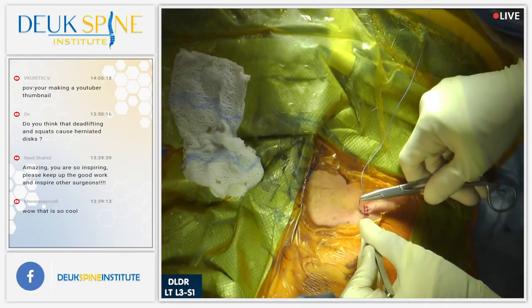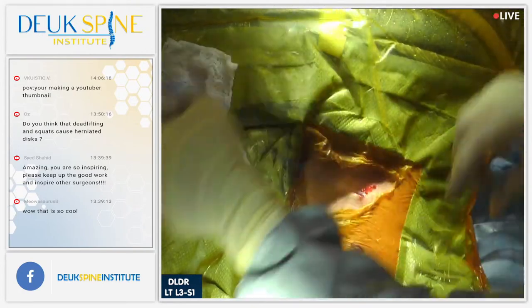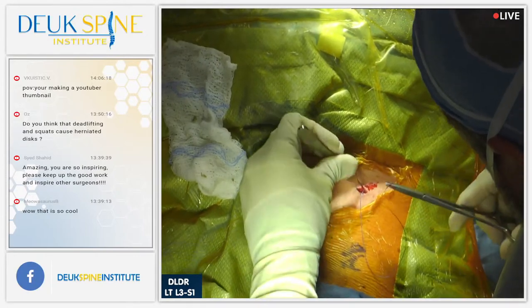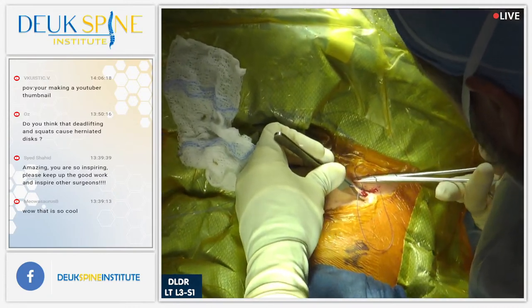Blood loss 1 mil. DLDR. This was a left L3-4, 4-5, 5-S1. Everyone agrees?